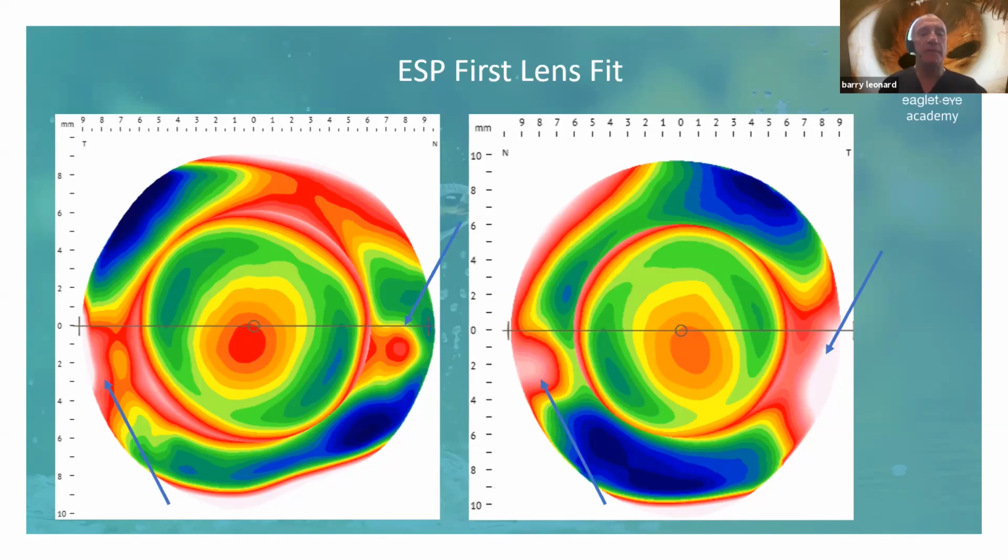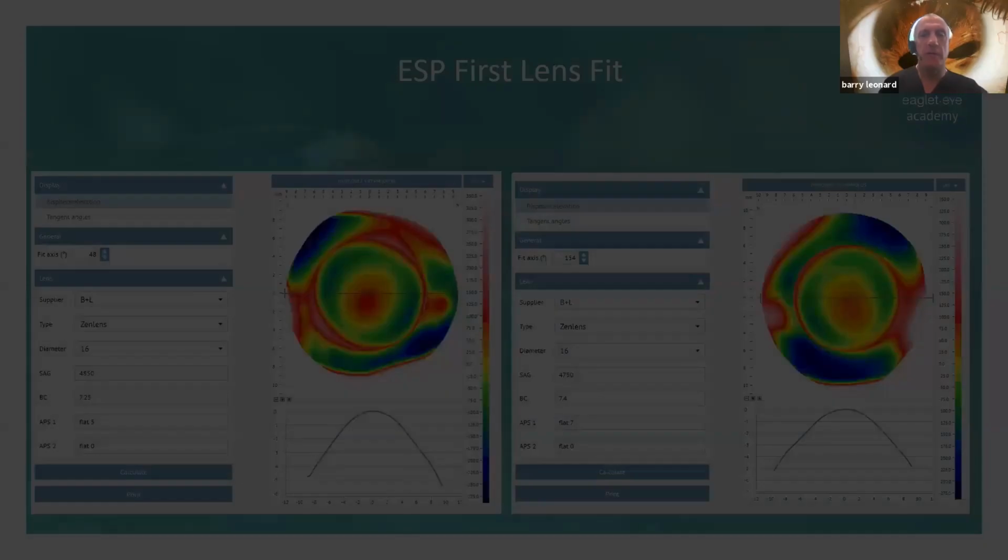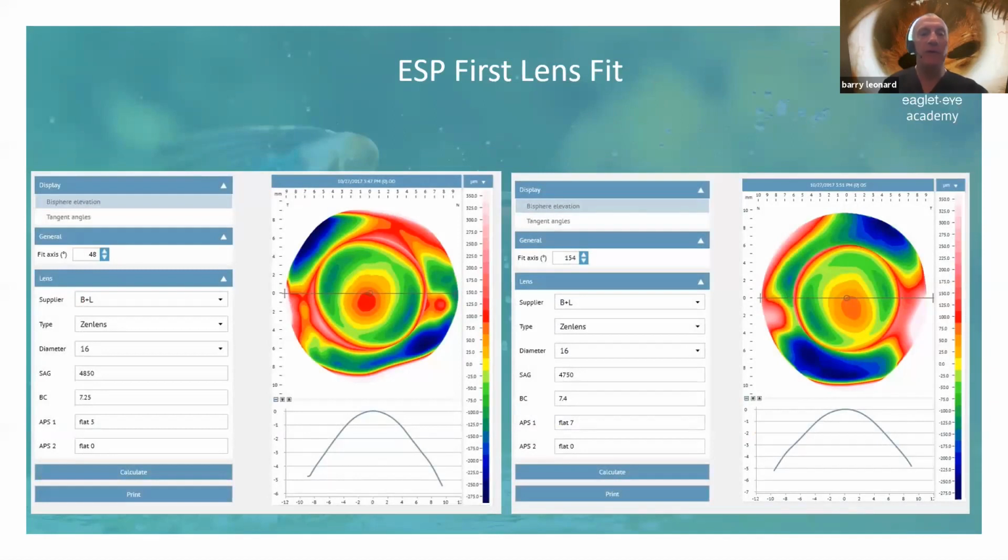We can see she's definitely also a little bit oblique in her scleral topography, and those arrows are pointing to some pinguiculas, which we're going to end up dealing with later. So in the next slide, I believe, see what you got, Renier's. Yeah, this is the first lens fit.